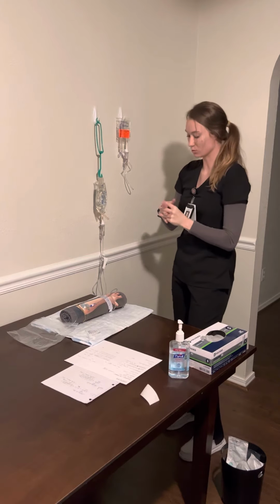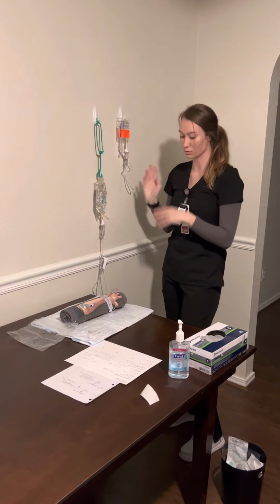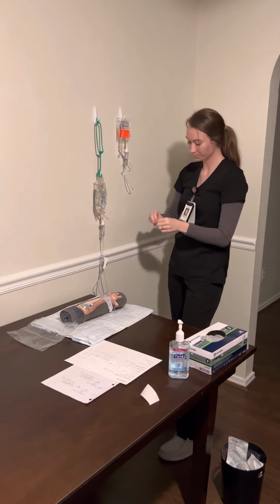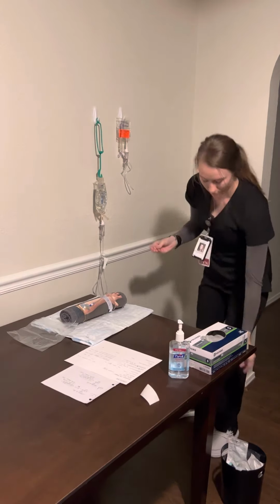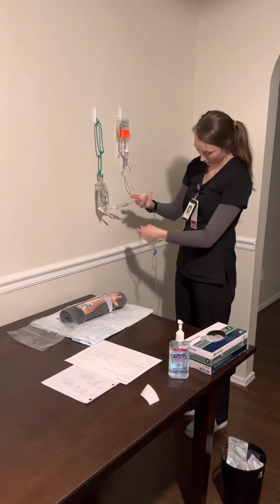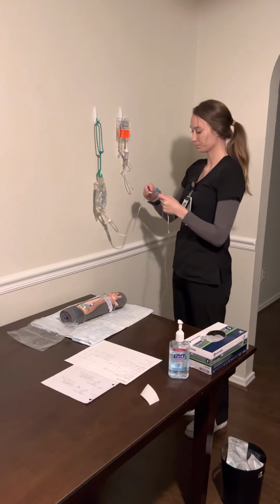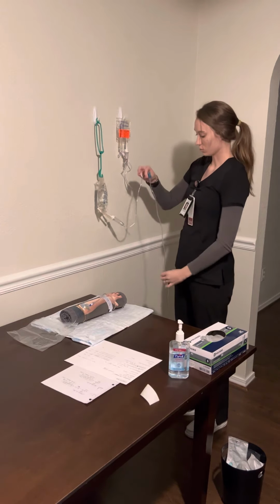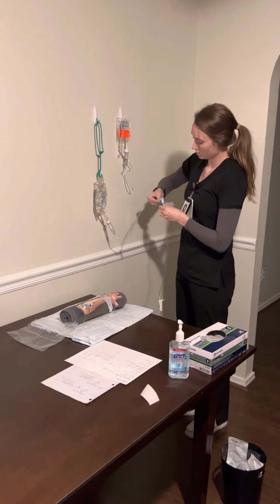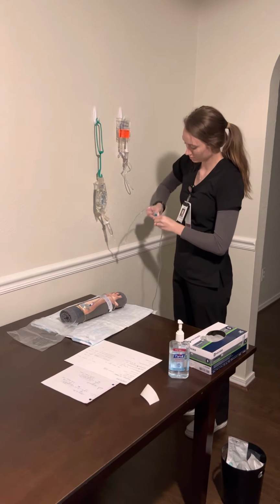It's now time to connect the secondary to the primary tubing. I'm going to grab an alcohol pad, find the Y port on this tubing, which is here. I'm going to scrub this site vigorously, make sure that it is clean.